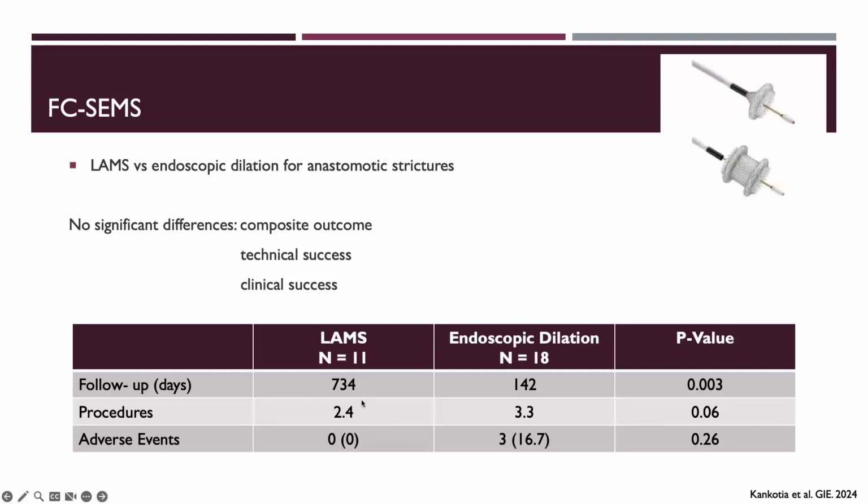You have to put it in, you have to take it out. You can't just leave it in there. There are times when the LAMS may just pass on its own and a patient may poop it out and be like, oh, I saw something, but that's typically not the case. You have to go and fetch it out.